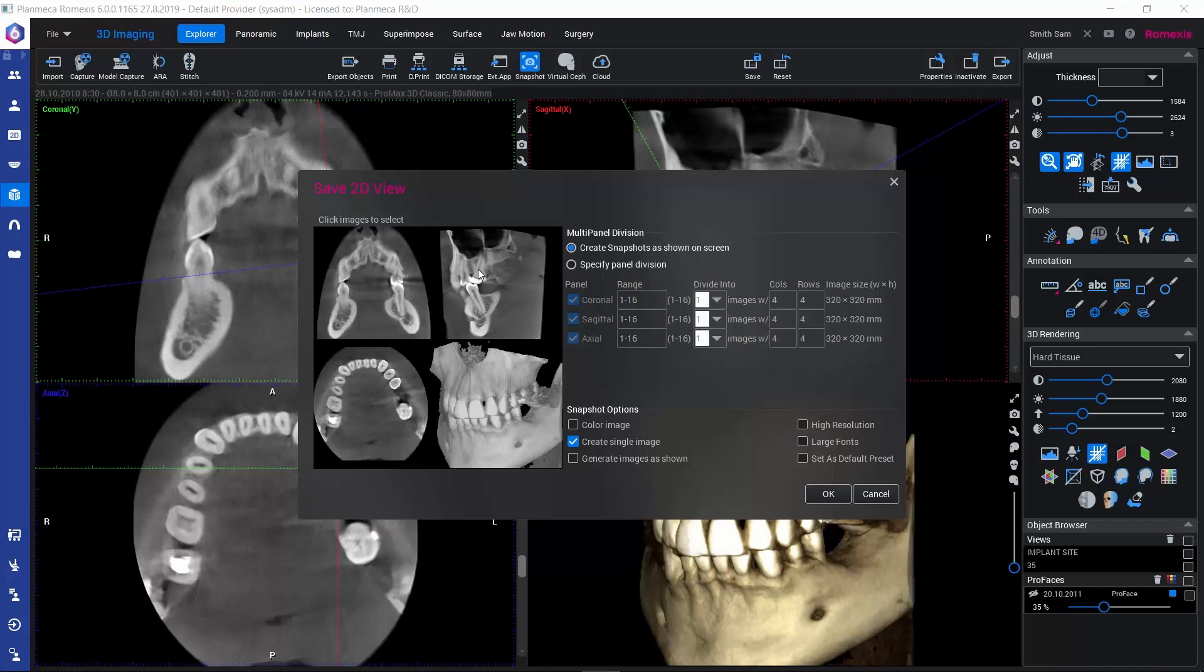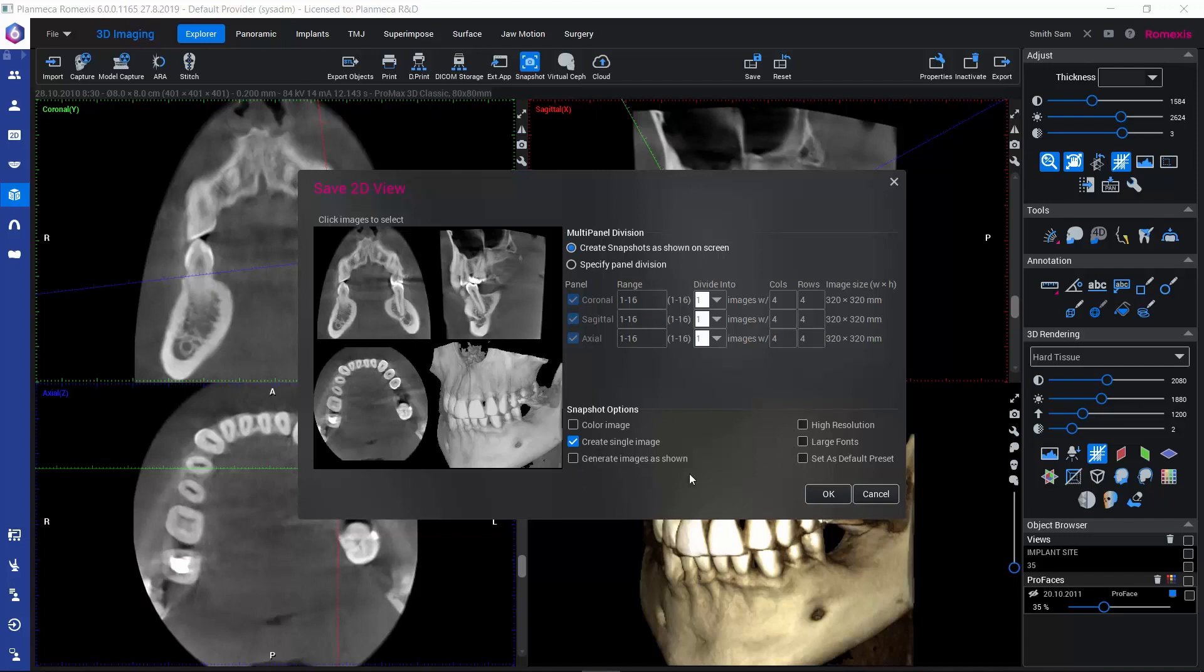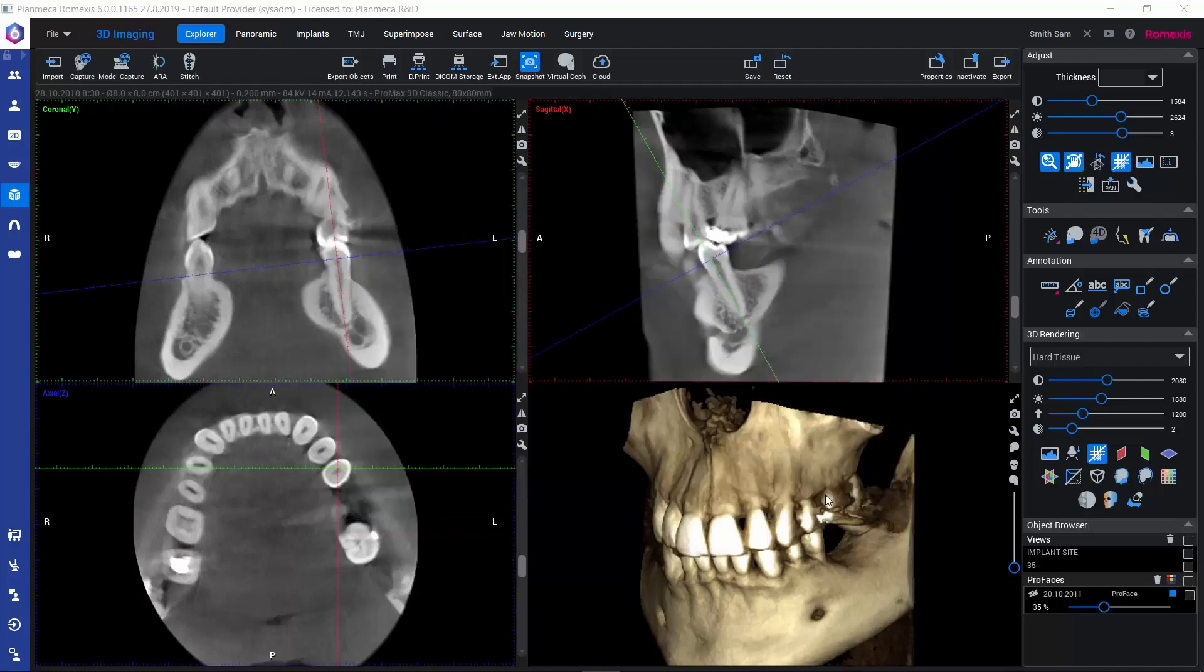If you have a low resolution image, the labels might appear a little bit grainy, so this might improve the situation. Large Fonts makes the font easier to read if we have any text on the images. And if we always prefer to use a certain set of settings here, we can save them as default presets so that the snapshots would always be saved with the same options. Once we're ready, we can click on OK.